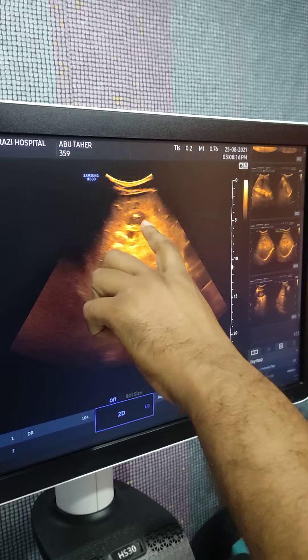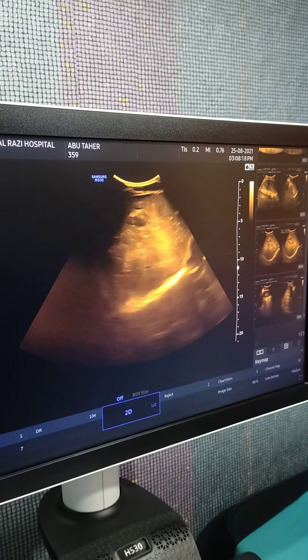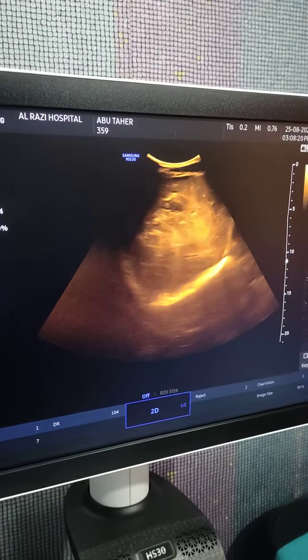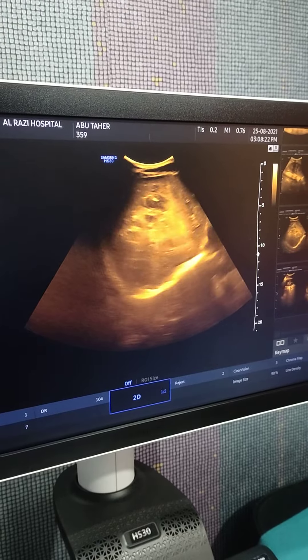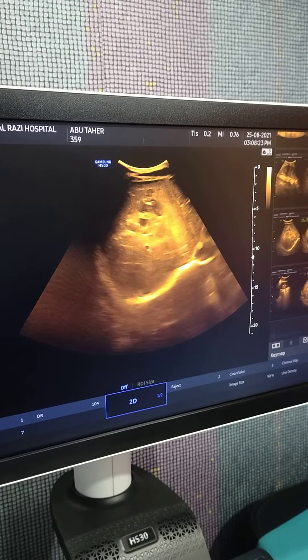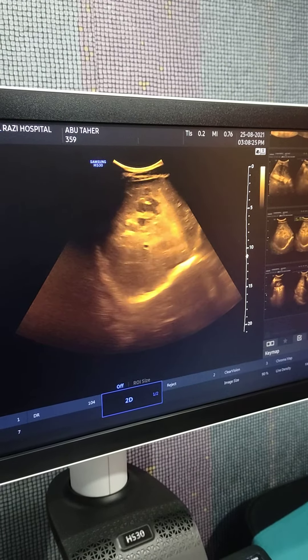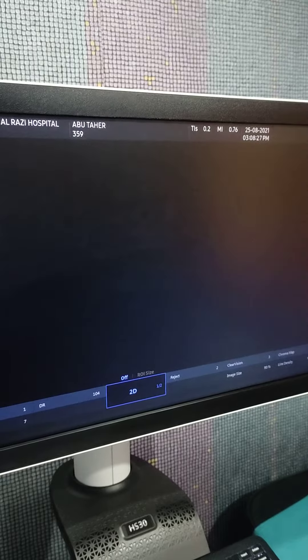Daughter cysts and echogenic material seen between the cysts, seen in the right lobe of liver.